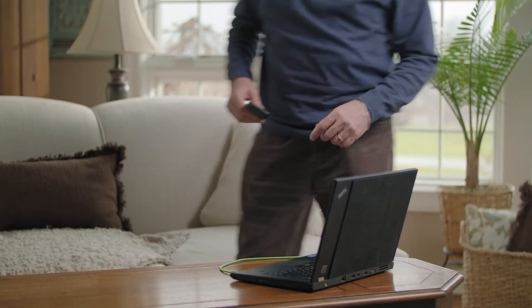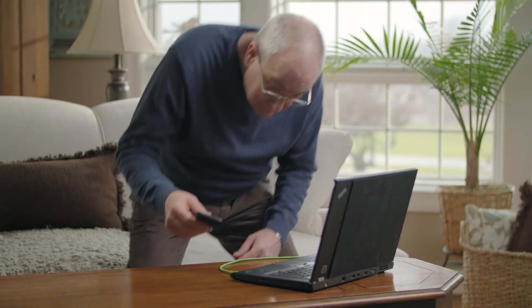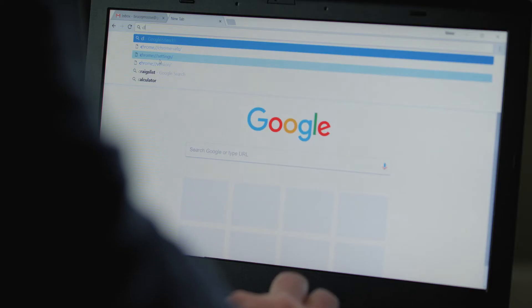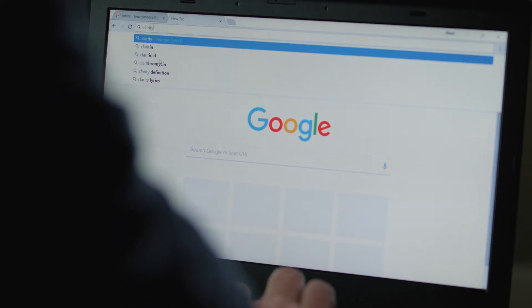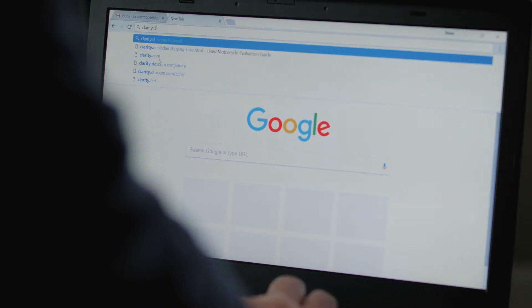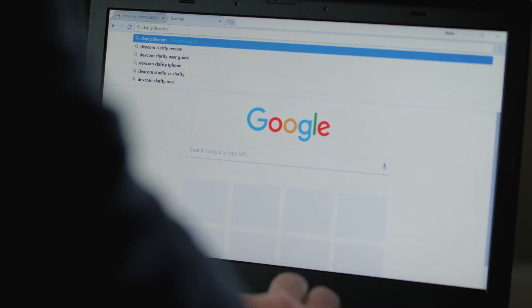At this point, you may have been on Dexcom G6 for a while now. So let's imagine you have a doctor appointment in a couple of days and want to be able to review your data together.